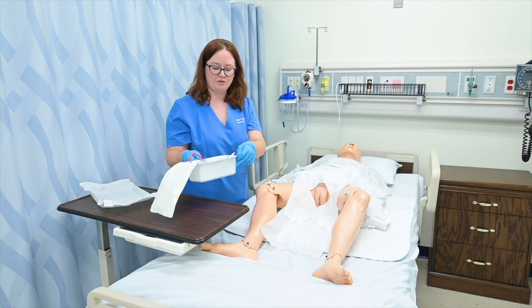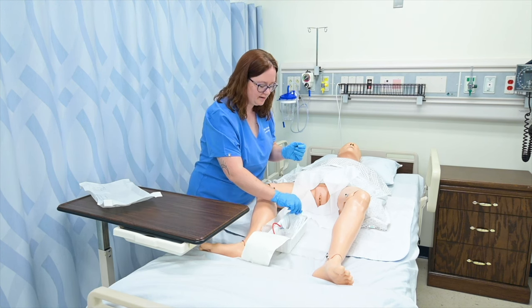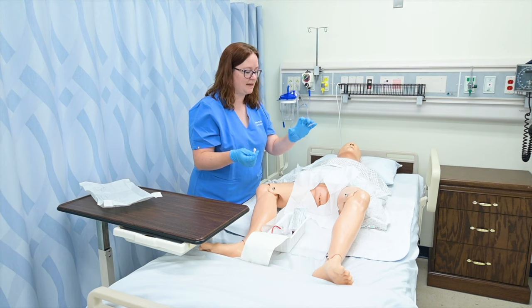All right, I'm gonna go ahead and move my tray. Oopsie, touching just the inside so that I can access it. I'm going to grab my first swab. And then just like before, once I touch my patient, this hand will not be sterile.